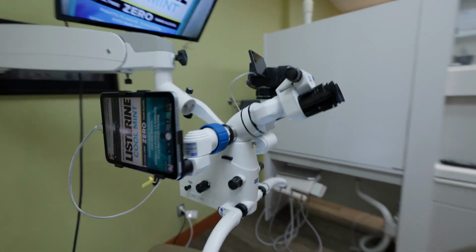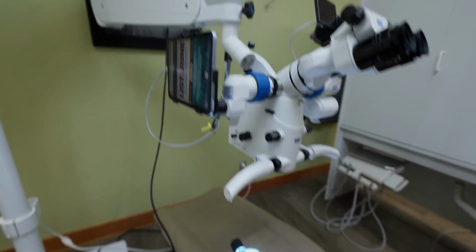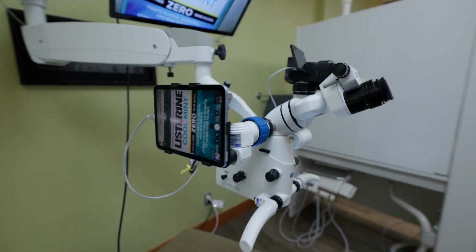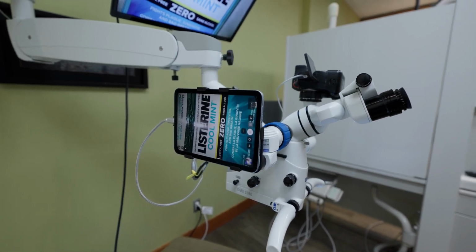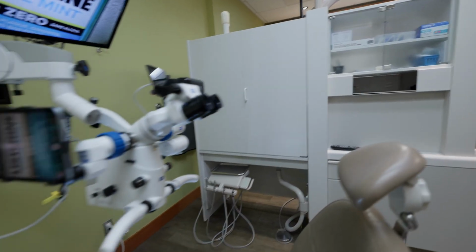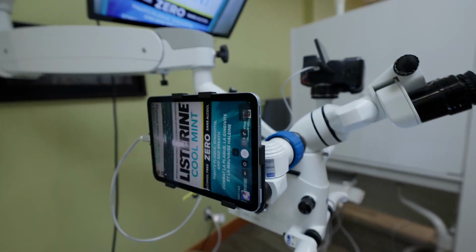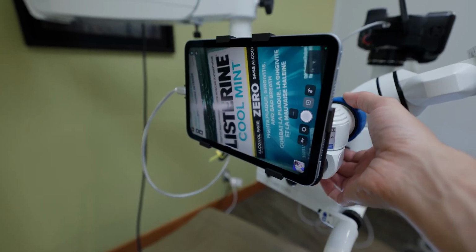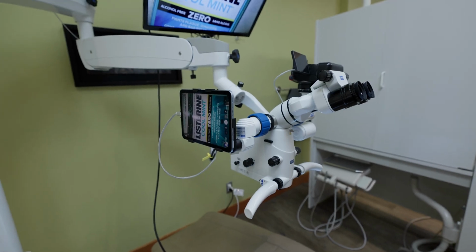So you'll see on this left side, an iPad mini is hooked up to the microscope and it is seeing what the doctor is seeing, which is this Listerine bottle currently. And this serves really well as an assistant monitor. So really, really nice option if you don't have an option for a TV in the room. Like we don't have any really good area to put a TV over there. So the assistant can see the iPad mini and use this as her guide. Really nice thing too is you can change the orientation of the image that the assistant sees so that it makes sense for them. Really, really nice option to make sure that your assistant can see something that's logical to her.